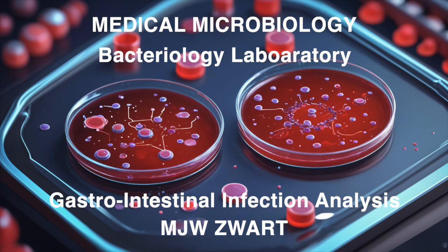Let's do it. Okay, first up, PCR. I know, it's pretty basic, but Gemini really points out how important it is for GI diagnostics. Definitely. We can use it to find the usual suspects: Campylobacter, Salmonella, Shigella, Plesiomonas, Aeromonas, Yersinia, straight from the fecal swabs. And if someone's been in the hospital for more than 3 days, we can even look for Clostridium difficile. What's great about PCR is that we can focus our cultures based on those results. No more wasting time on cultures we don't need. So it's kind of like our initial recon. It tells us where to go next.